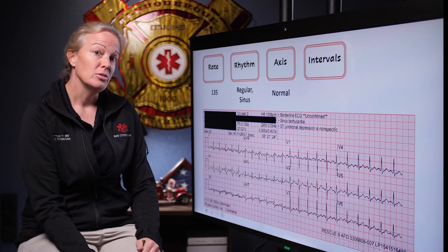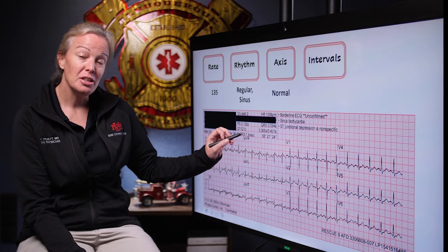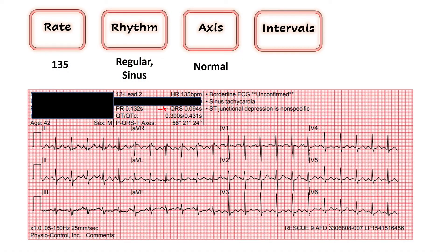Next we move on to intervals. We let the computer do the work here. The QRS is 94 milliseconds — we want that less than 120, so we're good, and they're nice and narrow. Our QTc is 431 milliseconds, which is less than 450. Remember, 500 is where you're at risk for spontaneous arrhythmias. I would call both of those intervals normal.